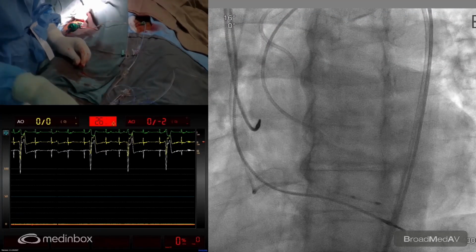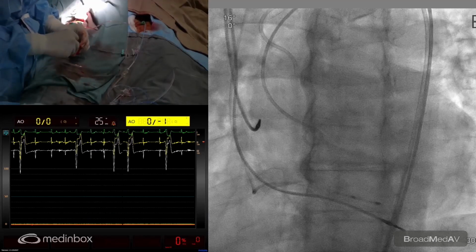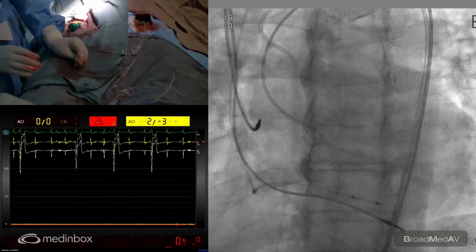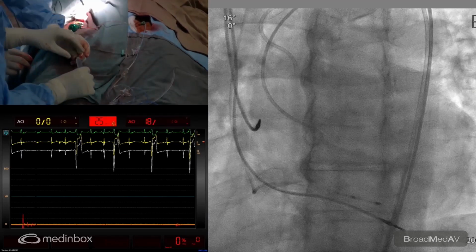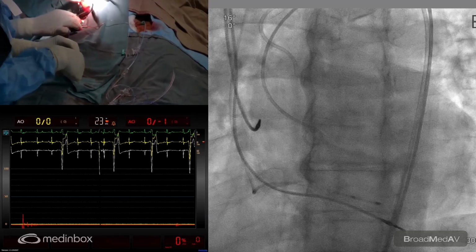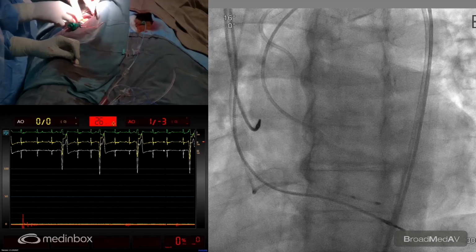Flush. Nanda, do you want to try? Yep. Anyway, you try, sir. Give me the wire again. So, soft wire, please.